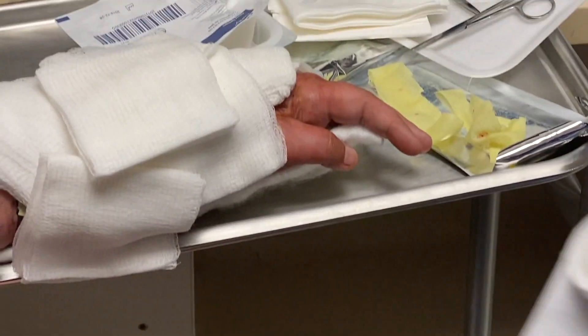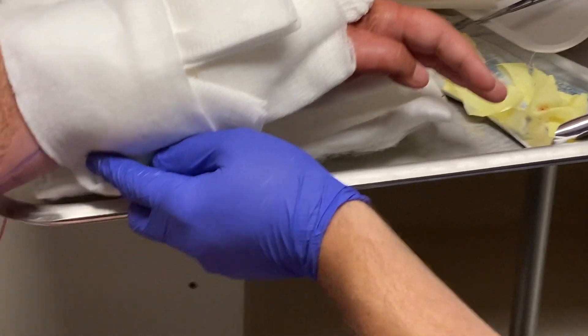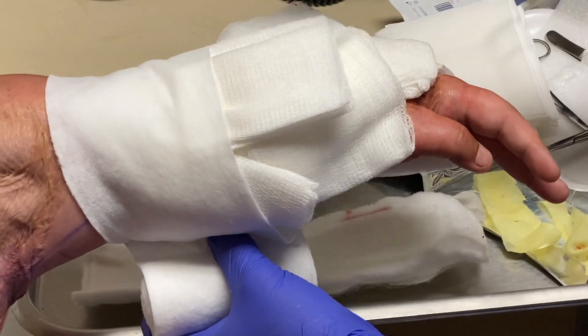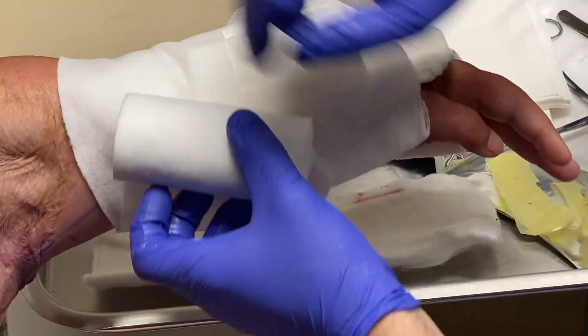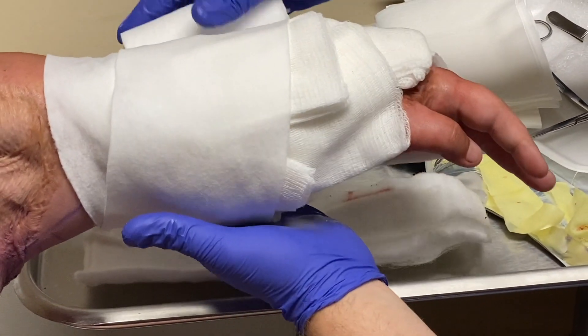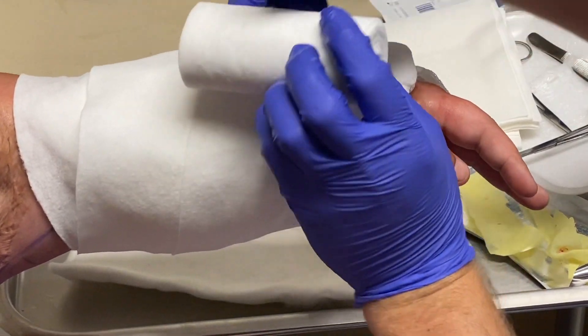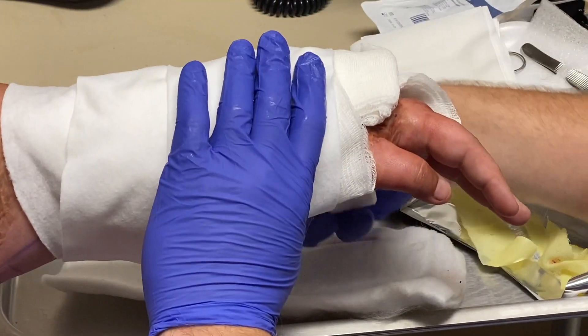Good old web roll for padding — way better than Krillix because it won't stick. And if it does stick, it's easier to pull off than pulling strands of Krillix out of a wound.